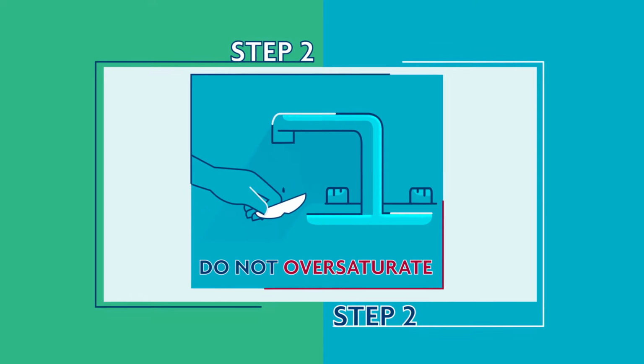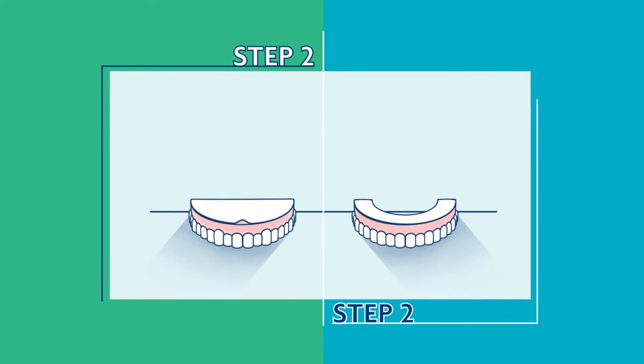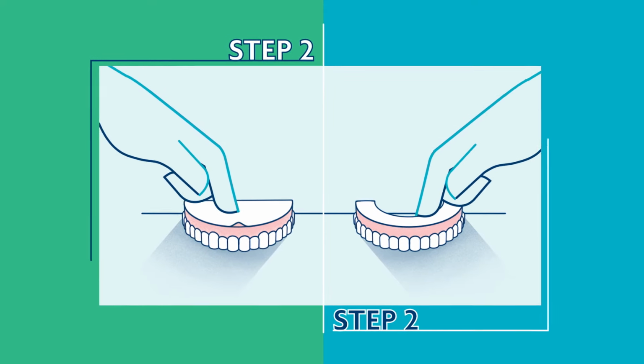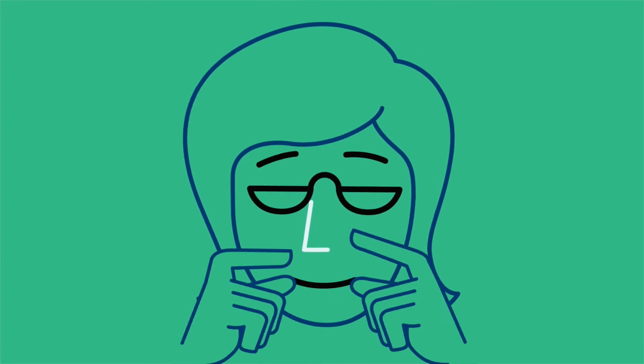Second, lightly moisten seal with water. Place moistened seal on denture, white side up, pink side down. Tap seal into place with your finger. Next, place the dentures into your mouth and bite down evenly until secure.